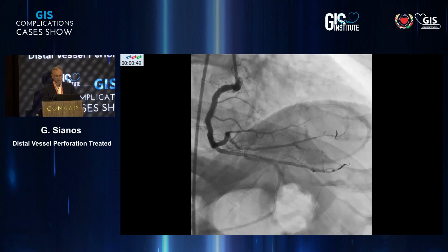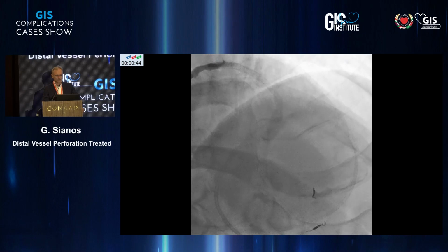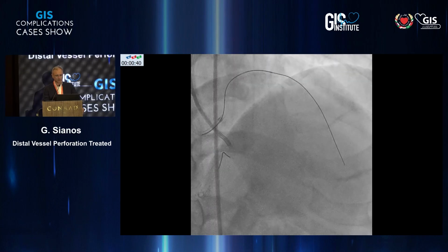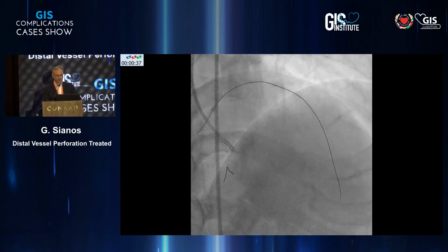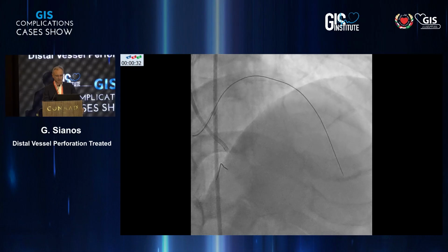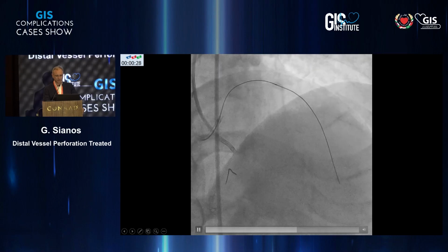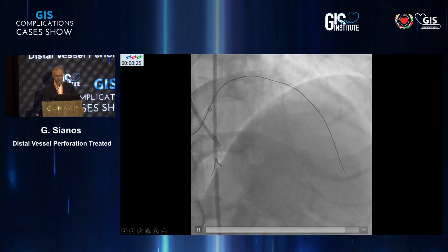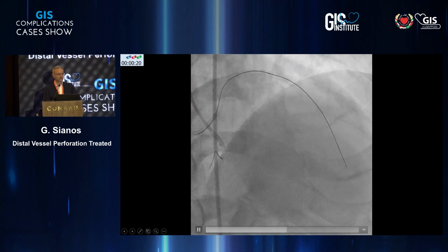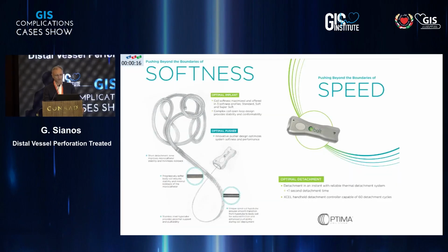Anyway, just to make the long story short, you see here the injection from the right, the pericardium became dry, and through this bilateral coiling, finally we solved the problem. But clearly, look at that, what I missed during the procedure. You push a balloon, this was before, and then when you're relieving the tension, although I had in mind with these very aggressive wires, see the wire, you release and it just dumps down like a knife and really perforates the collateral.